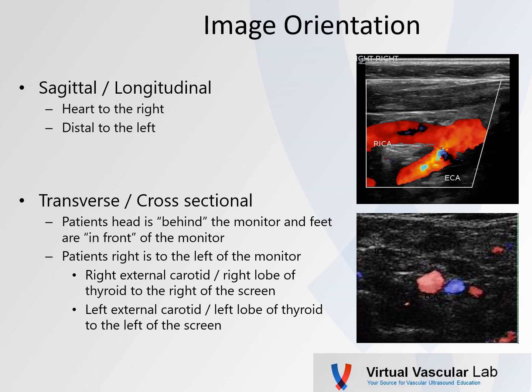A transverse or cross-sectional image is a little more confusing sometimes. The patient's head is really behind the monitor and the feet are in front of the monitor. Therefore, the patient's right is to the left side of the monitor. So in a transverse or cross-sectional view, the right external carotid or the right lobe of the thyroid, which is medial, should be to the right of the screen. For the left external carotid or left lobe of the thyroid, medial is also to the left of the screen. So remember: right external to the right, left external to the left — that's proper orientation.